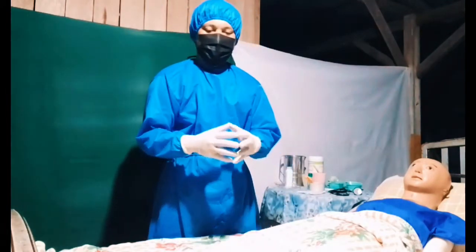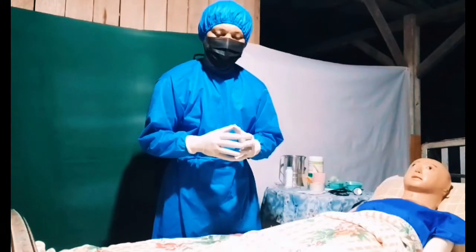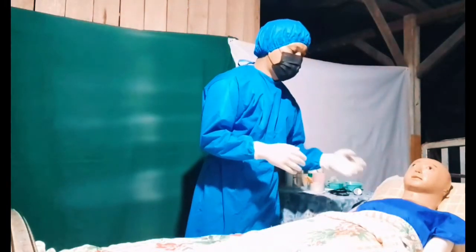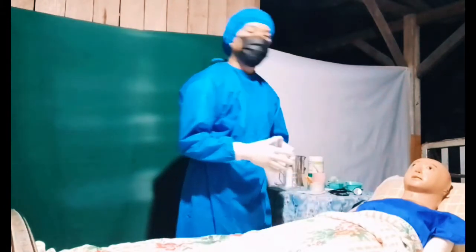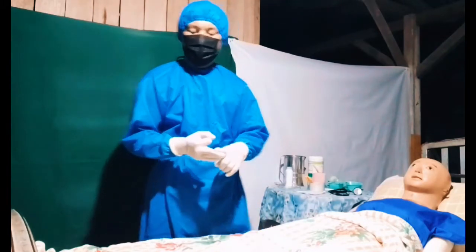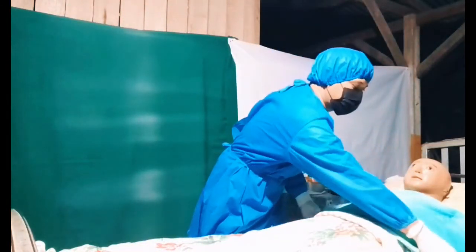Then, as if I'm done with the hand washing, put on the gloves. Then, after that, you must go to the patient's room, ask permission: is it okay, ma'am, to do the operation right now? And if it is yes, then provide safety, dignity, and privacy to the patient. So, first, put the towel on her chest, and on ma'am Pipay's chest to avoid messing up the bed.